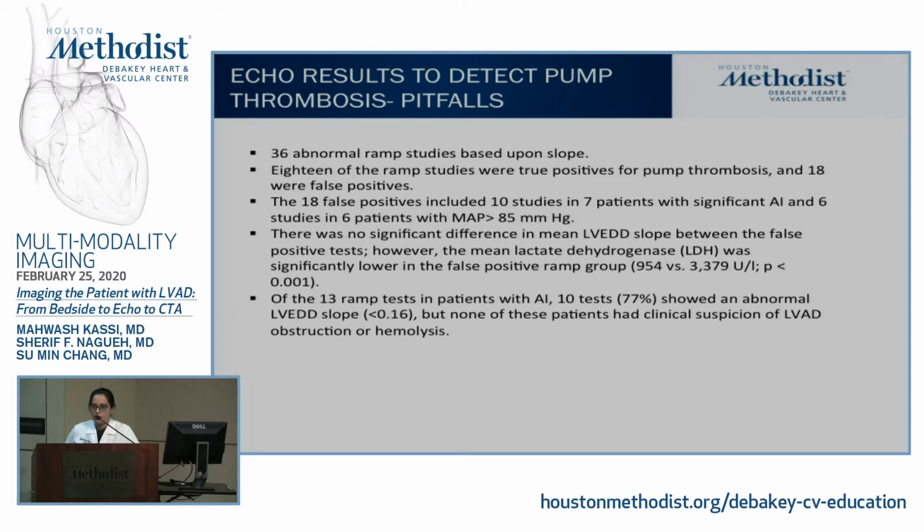And one other thing is, of course, the ramp study was falsely negative in 5 patients, and those 5 patients had poor outcomes. 2 of them died. So one echo alone should not be used to determine if somebody has a pump thrombosis or not. So you have to look at it clinically, and our HeartWares are actually better at that because they come with waveforms, so we can now see the waveforms of these patients.